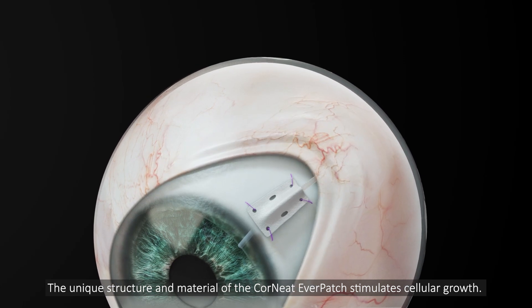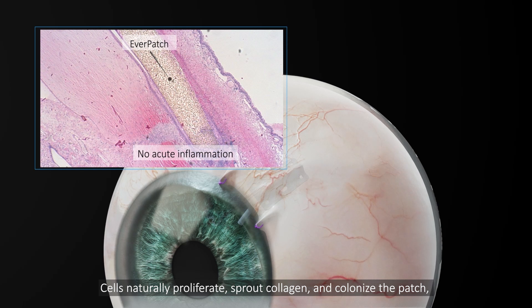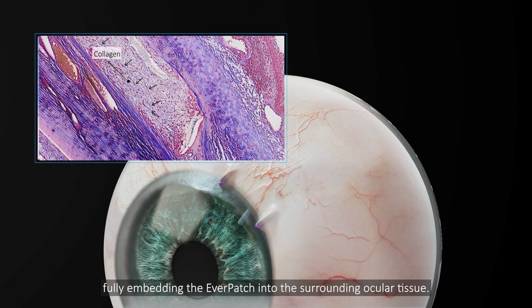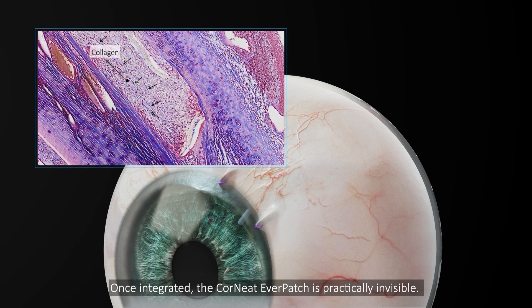The unique structure and material of the CorNeat EverPatch stimulates cellular growth. Cells naturally proliferate, sprout collagen, and colonize the patch, fully embedding the EverPatch into the surrounding ocular tissue. Once integrated, the CorNeat EverPatch is practically invisible.